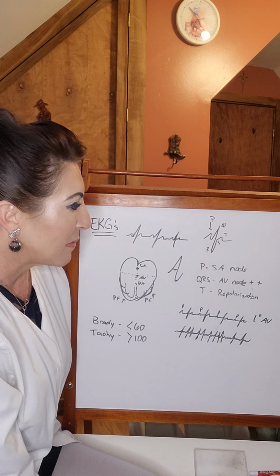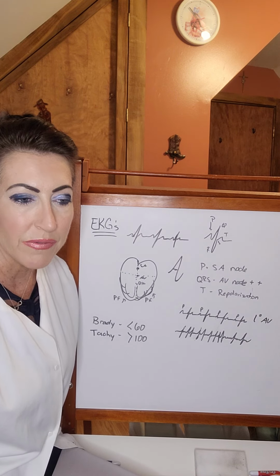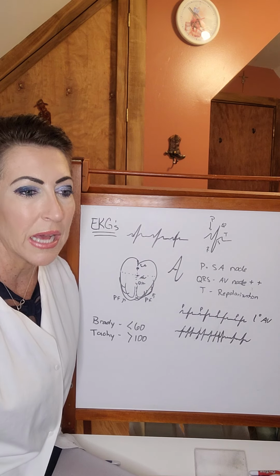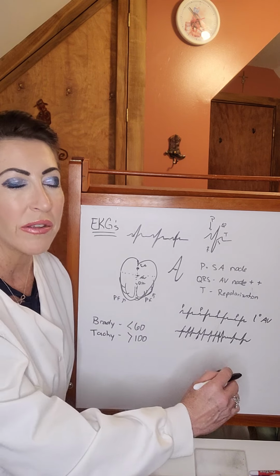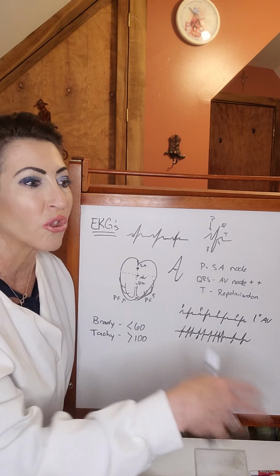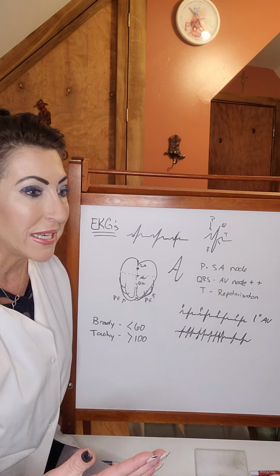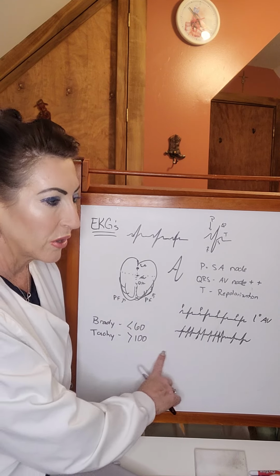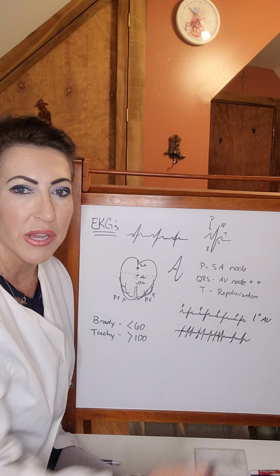If I can, maybe next week we'll do a little Wenckebach. Maybe I'll show you a couple of those. I've actually seen those, and they're so neat because as soon as you see one, you want to immediately print it out and show somebody when they're so textbook, on actual paper from a patient's heart, the way you've seen it in a book or in a class. It's really neat to see that is literally how it goes. It gets longer, and then falls off, and you're like, oh my gosh, there it is. And sure enough, it's gone, and you start all over.